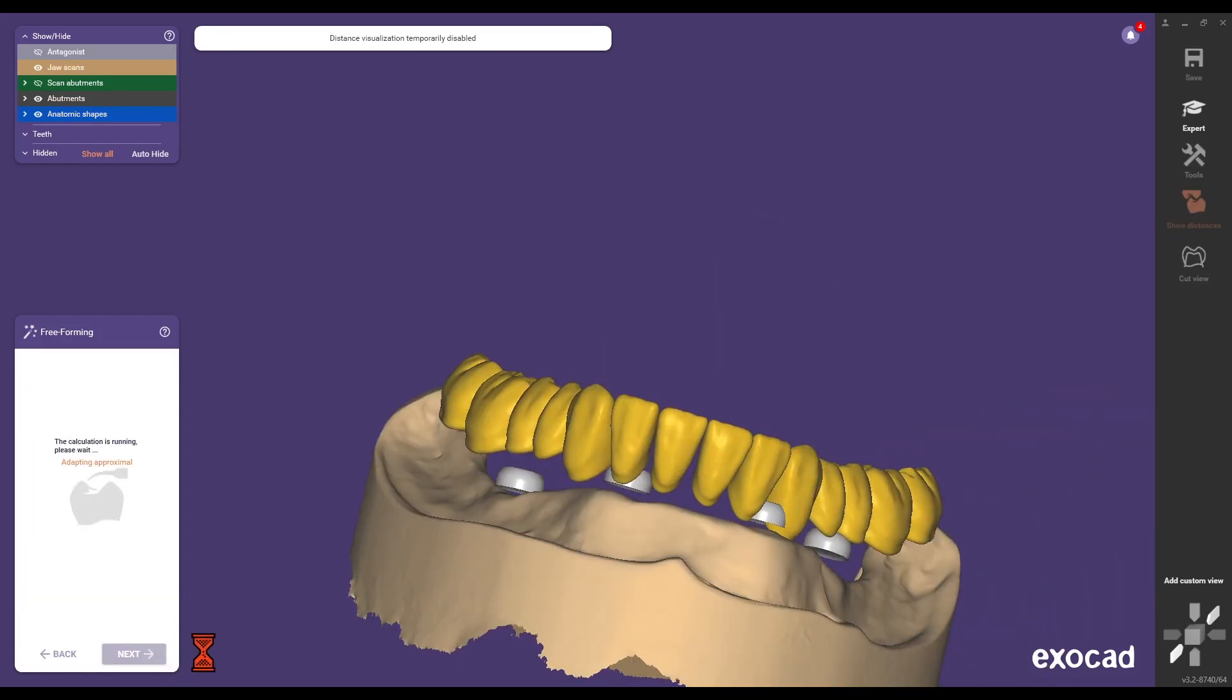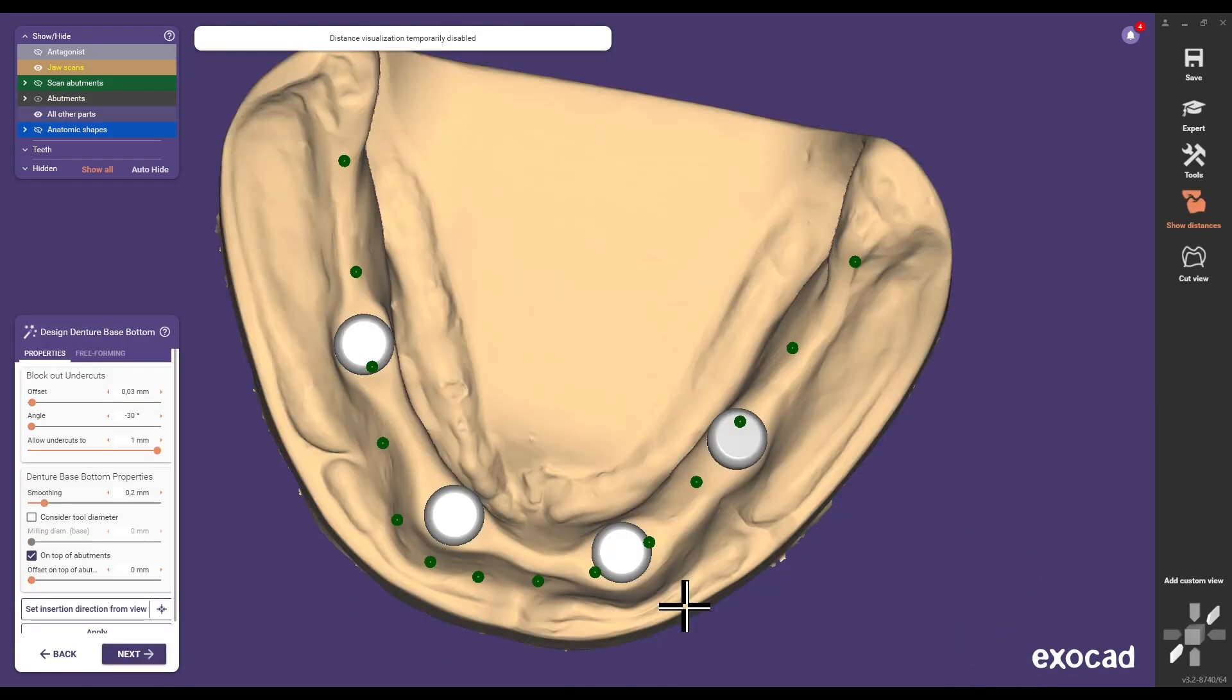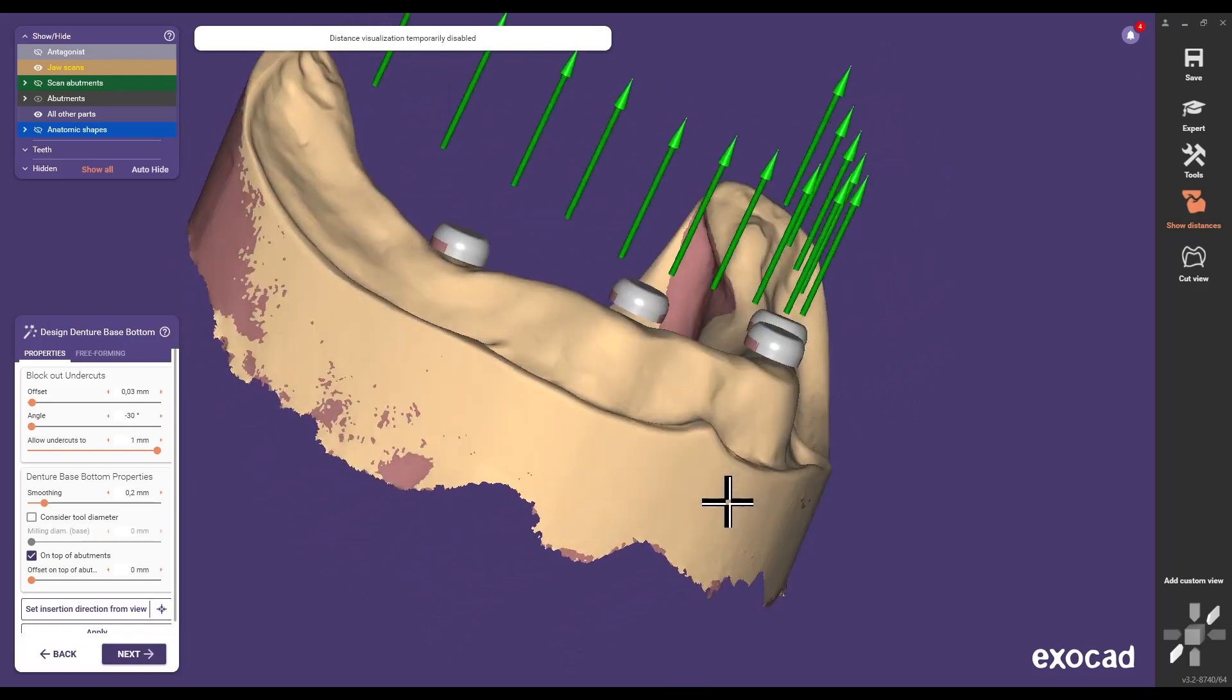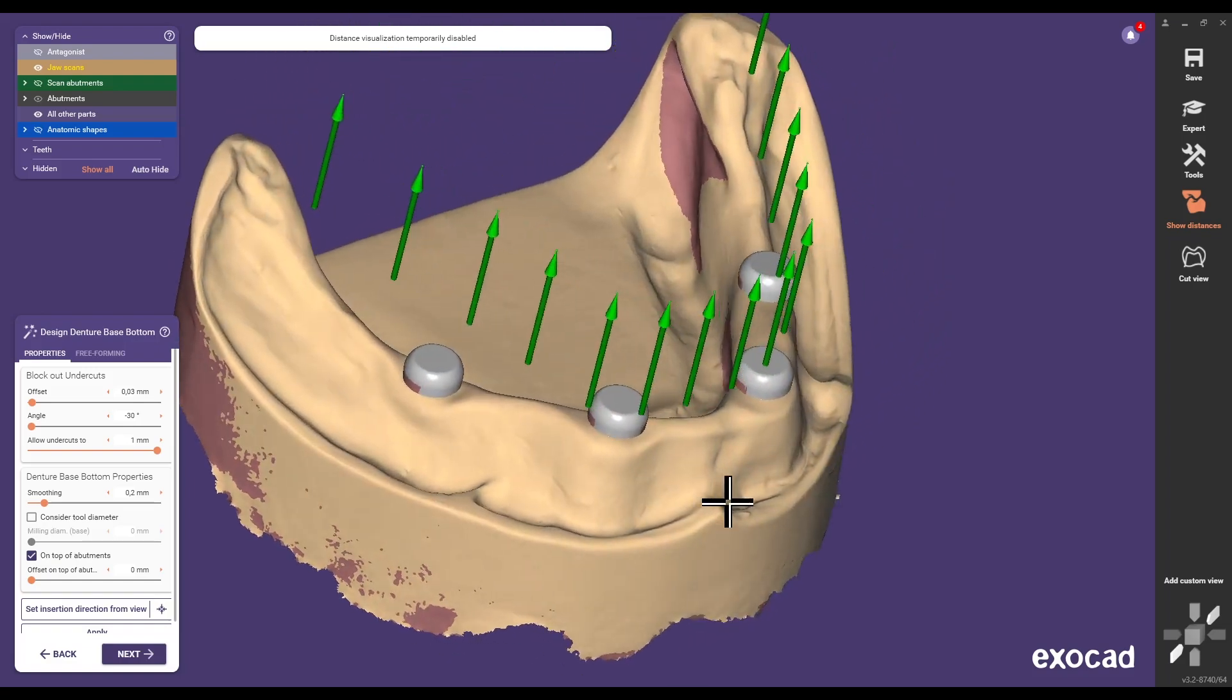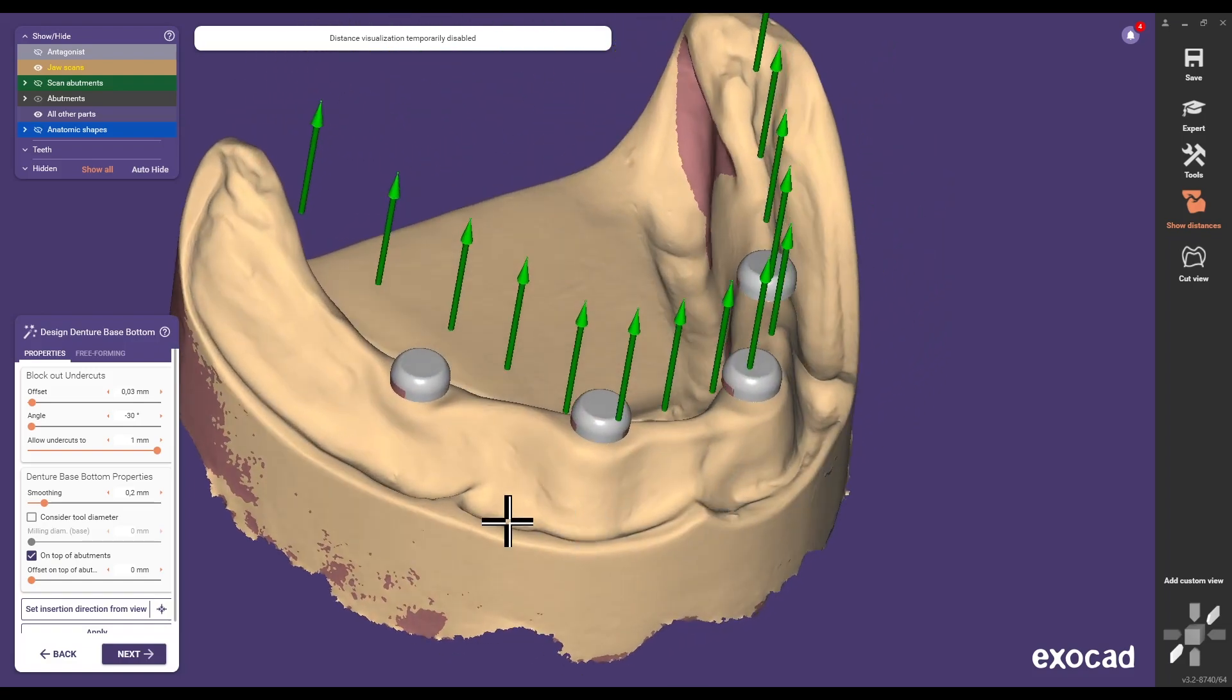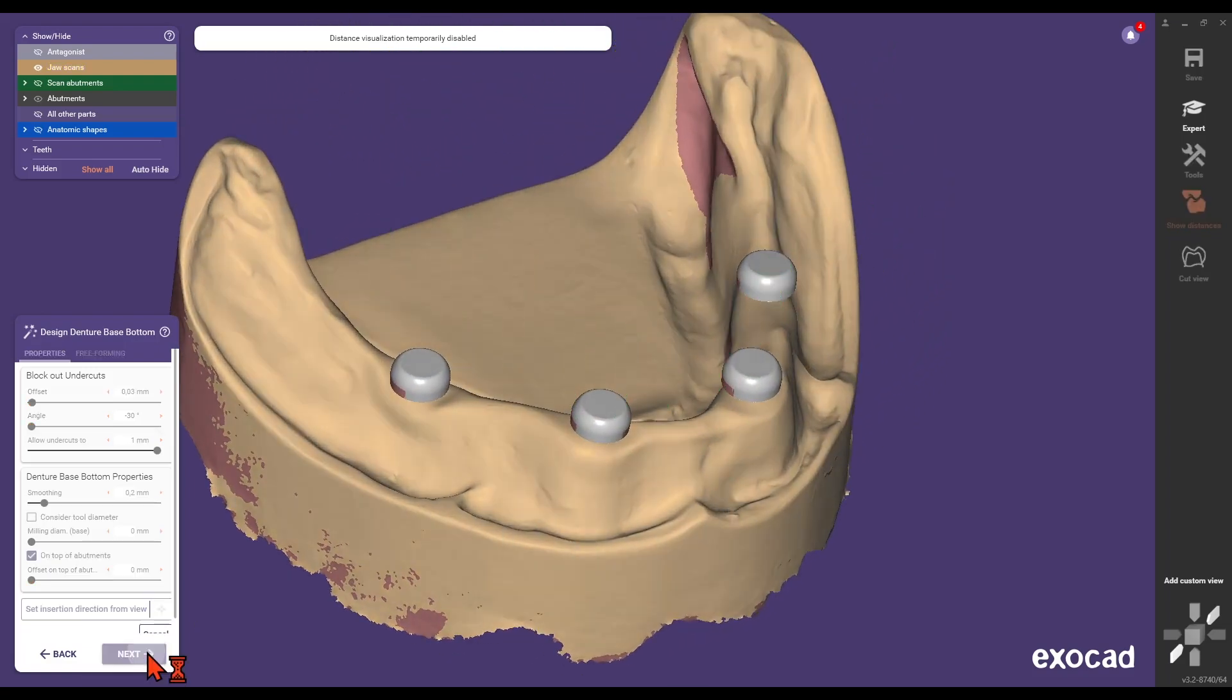Set the insertion direction of the prosthesis according to dental requirements. The software will block undercuts automatically based on generic or individually modified parameters.